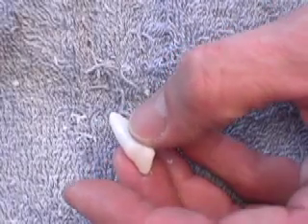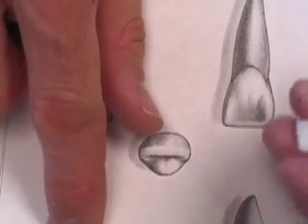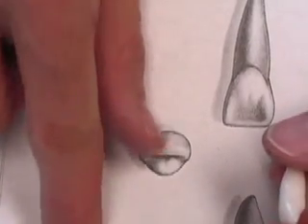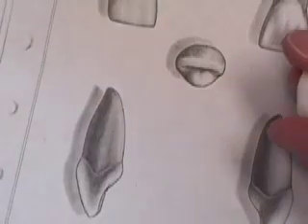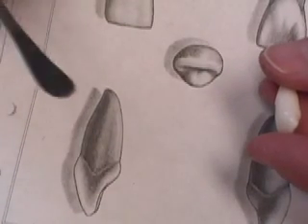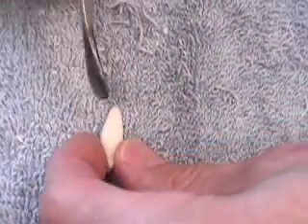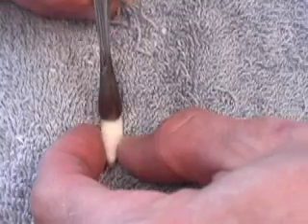The next feature of the anatomy we're going to form is the root anatomy. We'll be coming up on the mesial side. We choose our instrument based on the size or shape we want to form, so we're going to use the back side — the larger side — of a wax spatula. I'm going to come right up that root and up into the crown just a little bit.